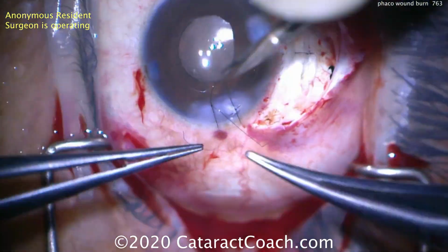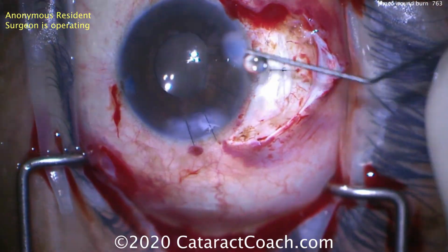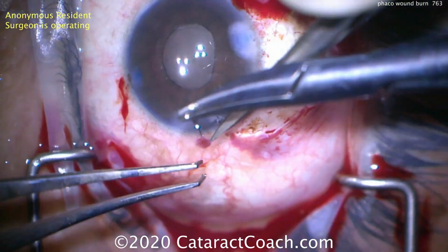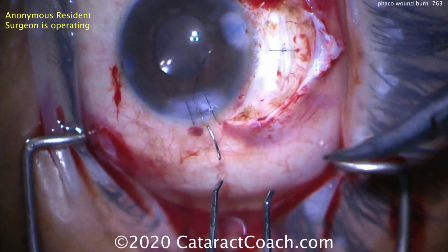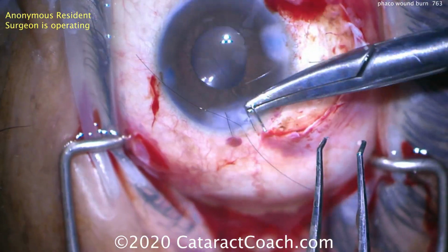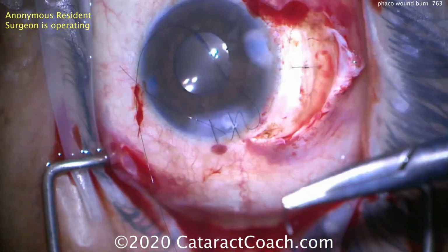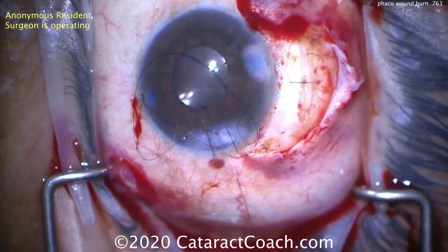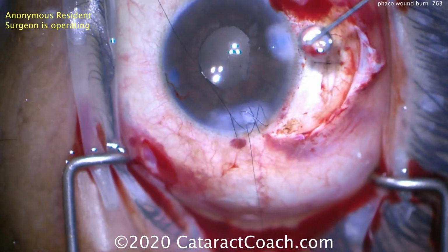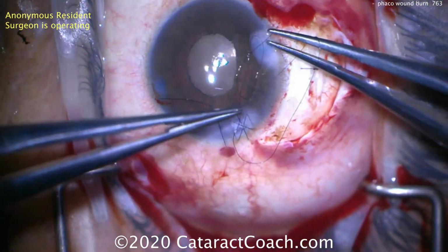Here at the end of the case, the IOL's in the capsular bag. That looks great. But look how many sutures are going to be needed to close this cornea. You put in the 2 sutures, it still leaks because remember the heat congealed that corneal tissue. The cornea is protein, like an egg white. Once you use heat and you cook the egg white and it goes from transparent into totally opaque and white, well, how do you undo it?